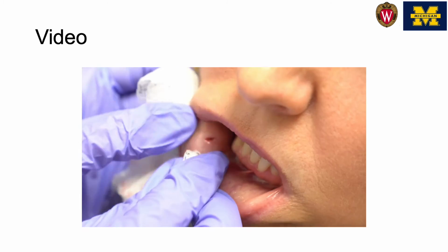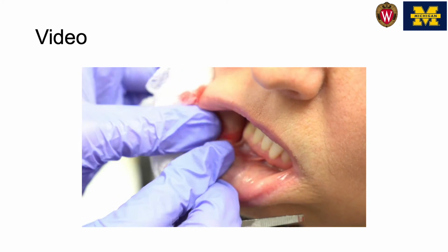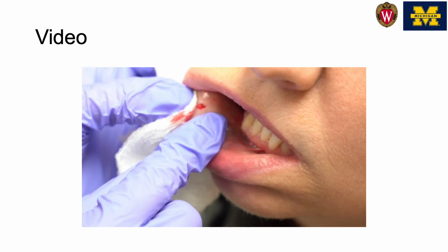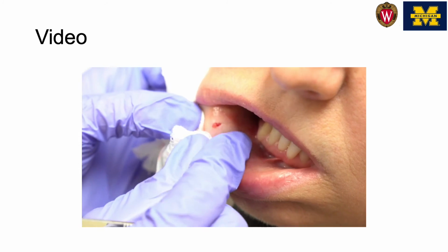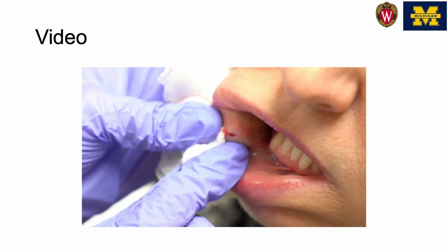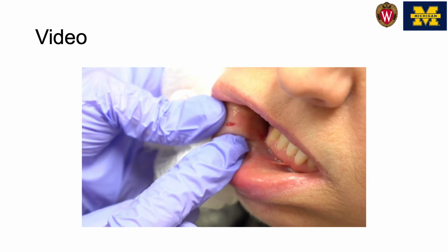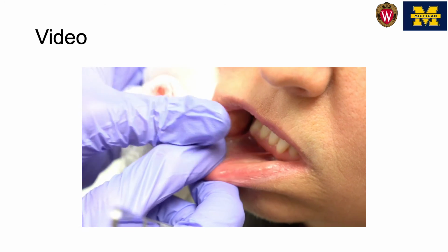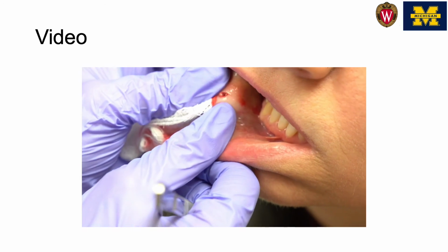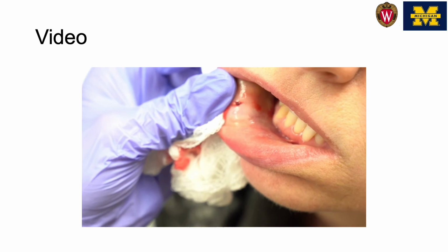Upon superficial inspection, we don't see any additional labial salivary glands. I could potentially extend the incision a little bit more. However, instead what I'm going to do is use the incision that I've already created as a sort of window, and I can move it around this very superficial incision such that we can potentially see additional labial salivary glands using this window without having to extend this incision, which I would never want to extend more than about 1/2 centimeter if avoidable.